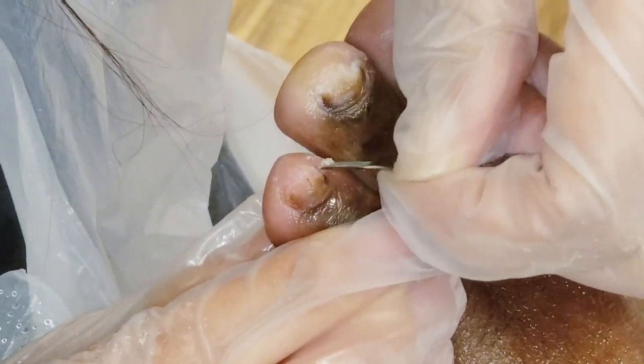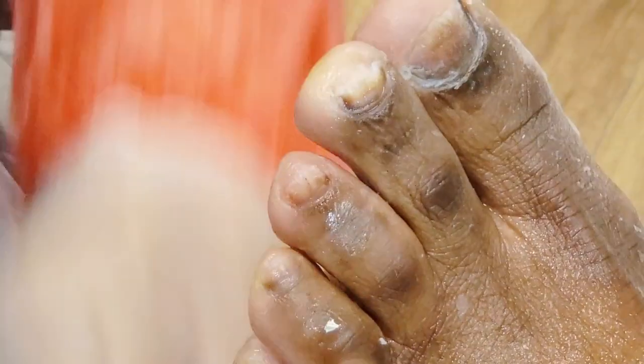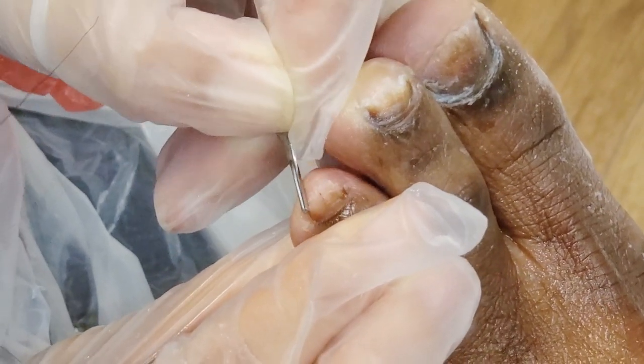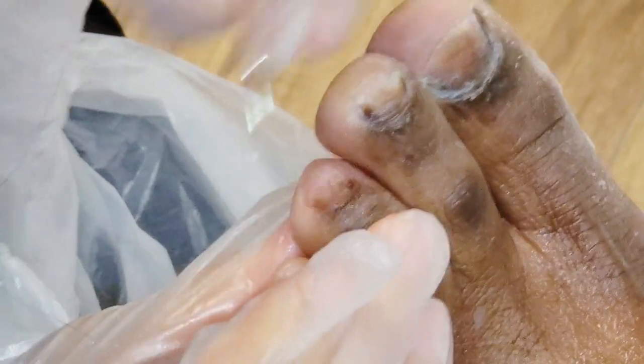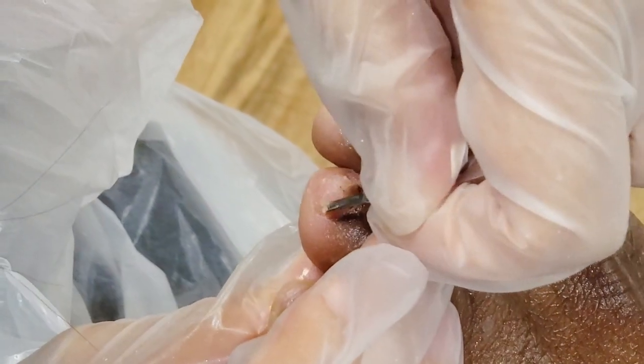Tell me if your hand goes numb. The difference between this and nail surgery is that I can't remove the fungus all the way down from the root — I'm trying to clean as much as possible because that's quite painful and requires an anesthetic.